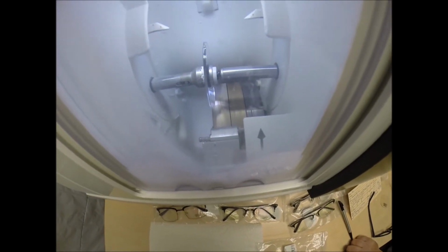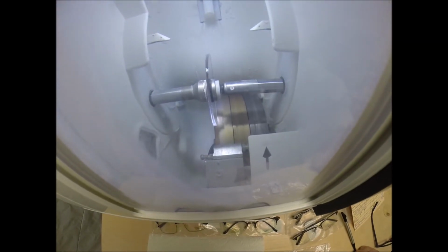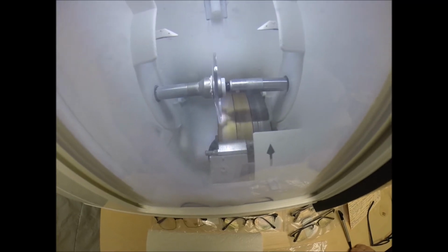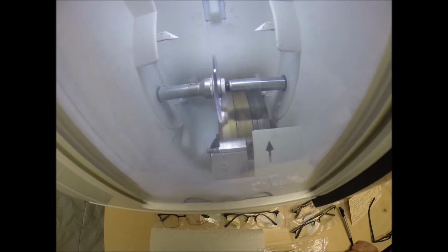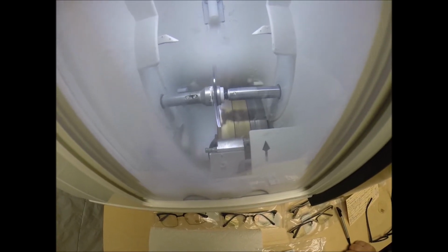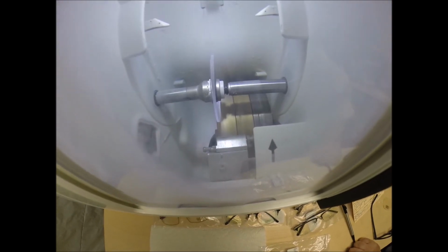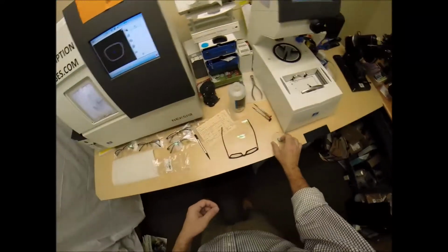The cutting wheel is starting. Now if you see light flickering in the background, that is water there to catch the optical sawdust. Polycarbonate lenses cut dry, where plastic, high index plastic, and Trivex cut wet. Water will spray onto the cutting wheel for the lens and the cutting wheel for the last 20 seconds just to wash away any optical debris that you may see beginning to form around the edge of the lenses. Now your lenses are made out of polycarbonate.